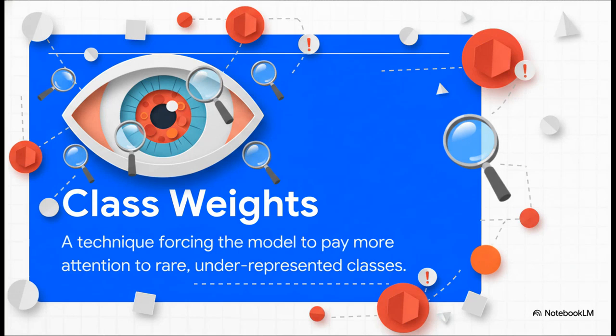So how do we fix that? The solution is actually pretty clever. It's a technique called class weights. In simple terms, we're telling the model, listen, I want you to pay way more attention to these rare disease cases. In fact, if you get one of those wrong, the penalty is going to be huge. It's like putting a weighted grading system on its test. This forces it to focus on what's important, not just what's common.